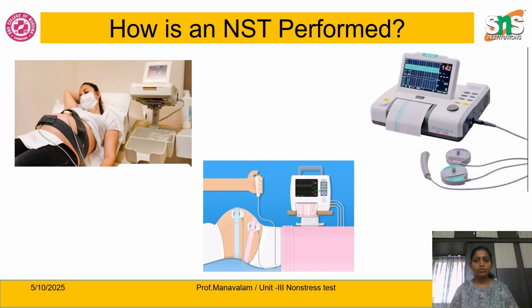So before doing this procedure, we have to do certain preliminary steps. We have to ensure that the mother is feeling comfortable, either in a semi-sitting position, in Fowler's position, or lying down in a supine position. We can do this procedure in a side-lying position also. We can make the mother lie down in side-lying if she is feeling uncomfortable.